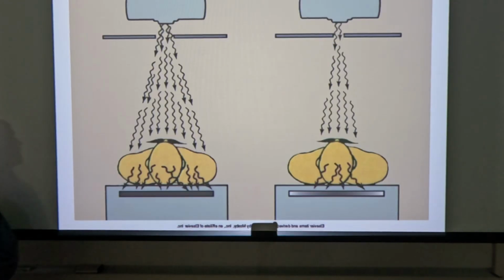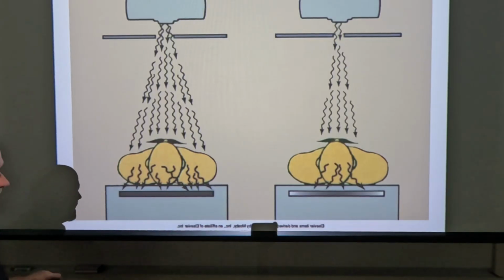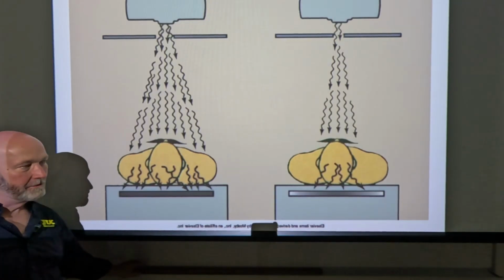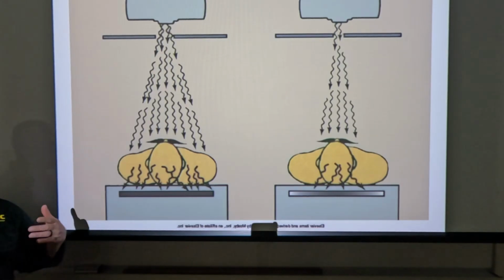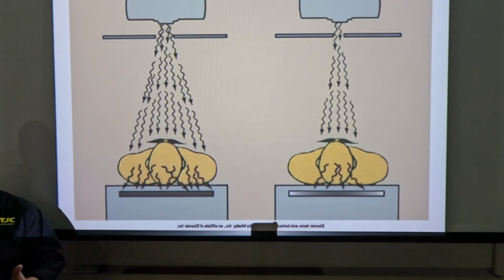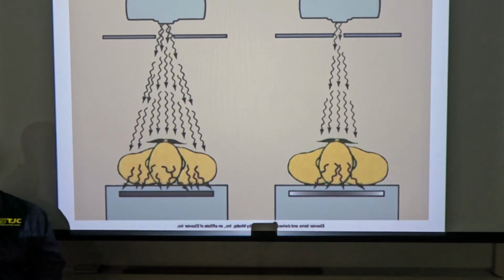All right. So beam restriction. So you restrict the area. What I want you to not lock into your mind is you're not focusing the X-ray beam. X-ray is not a laser. You can't focus it. It's beam restriction. It is not beam focus.